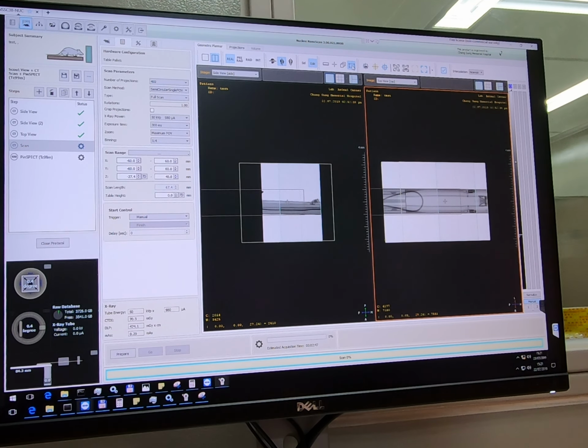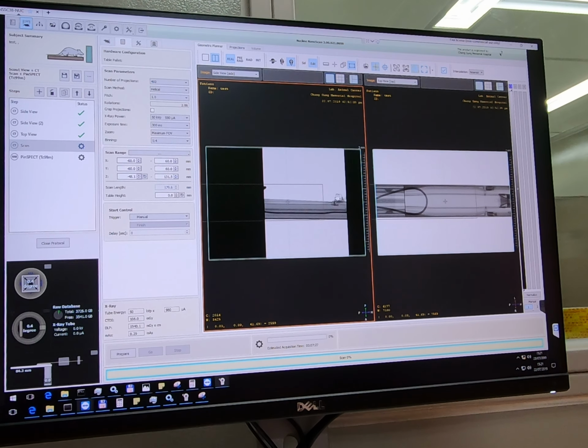But if you select the helical, you can cover the whole volume, and it also displays that it will require almost 3 rotations. Because the single field of view will always include only 1 rotation. That's the main difference. And of course, the single field of view scan is always faster because it's only 1 rotation.